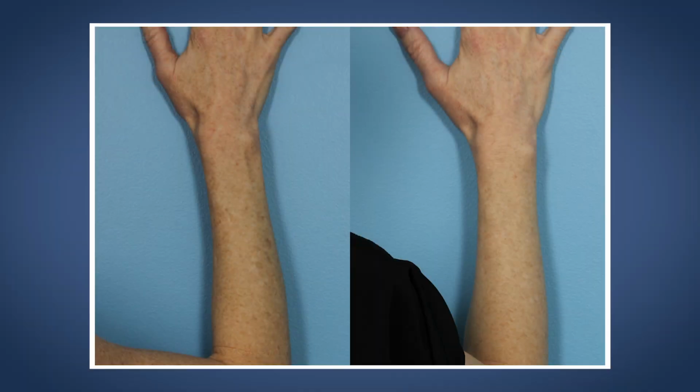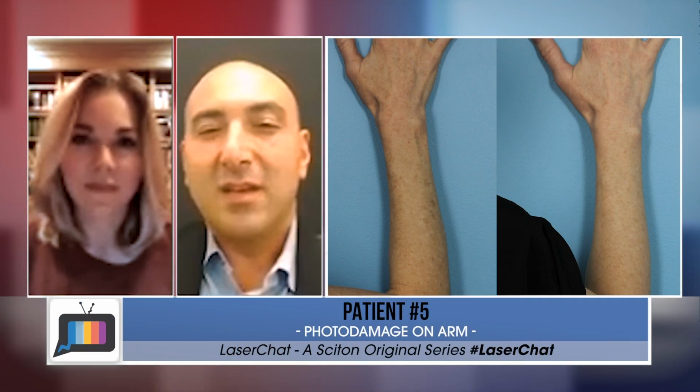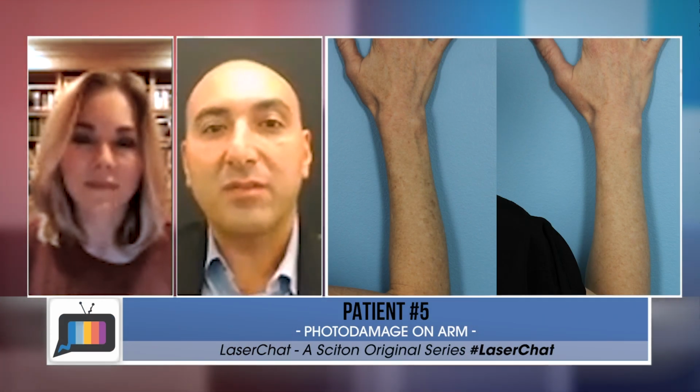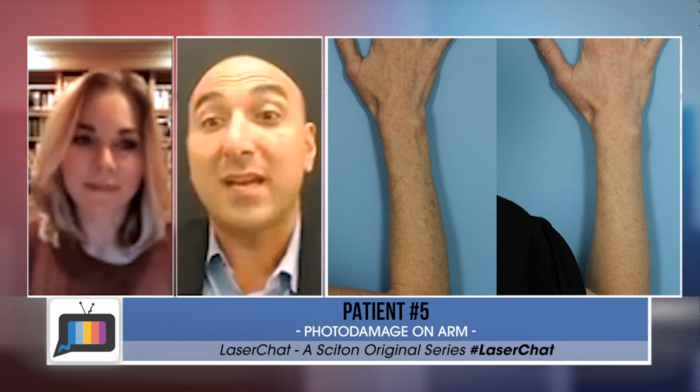Yeah, I like a couple of things you've said, definitely. I definitely do any kind of ablation first, because then if you're going to do either Moxie or Halo over that, you want to improve any kind of pigmentary anomalies that you've left behind from your ablation. I do find that the single spot handpiece, there's less of a chance of the hypopigmentation that you might get with some cryo. You're just so much more precise with the erbium than with cryo.